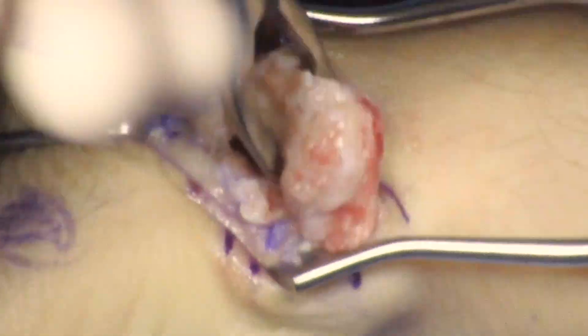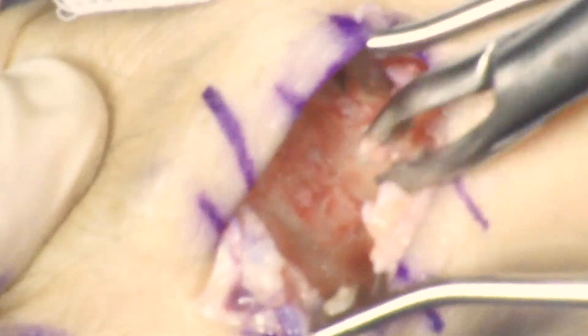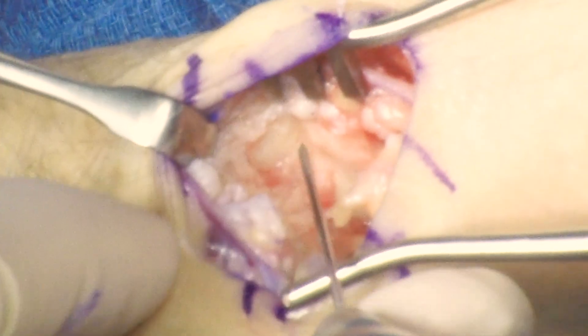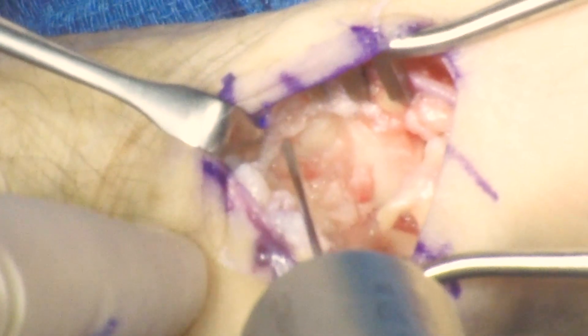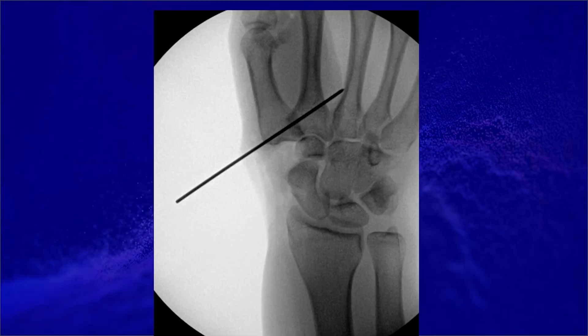You want to palpate the arthroplasty space to make sure there are no remnants of the trapezium, and also palpate the space between the base of the first and second metacarpal to ensure there are no loose bodies or remaining portions of the trapezium. The first guide wire is inserted. The articulation between the trapezoid and the second metacarpal is identified and the guide wire is inserted. Typically start 5 to 7 millimeters distal to the second carpometacarpal joint at the distal aspect of the articular surface with the trapezium, and aim 45 degrees distal.